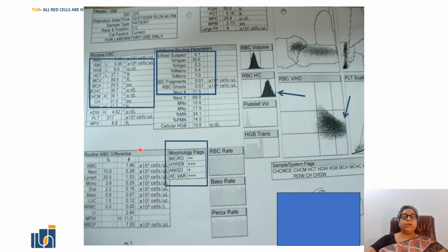Now the next case. Again over here, if you see the RBCs are less, hemoglobin is about 9.9 and the MCV, MCH and MCHC are slightly increased. The RBC volume shows a few microcytic cells, but otherwise it's predominantly normocytic, normochromic. But in the hemoglobin concentration graph, there is a nice shift to the right. And similarly in the scatter plot, there's a nice shift to the right. The percentage of hyperchromic cells is 30% because MCHC is also suitably increased at 36.7. The flags show hyperchromasia, anisocytosis, and a hemoglobin variation. There's also microcytosis. So there's microcytosis, plenty of hyperchromic cells, which are obviously the spherocytes because spherocytes are what sit over here.